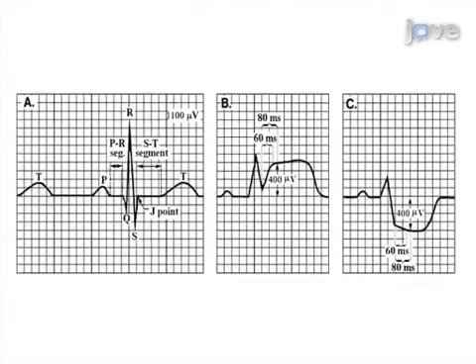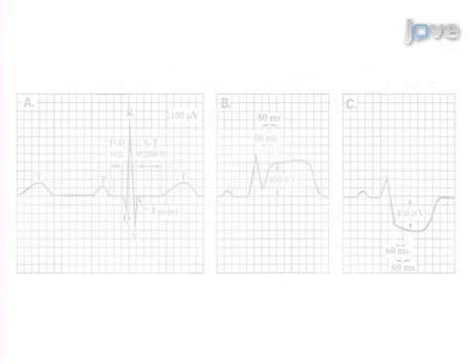Analysis of the data reveals the presence of transient myocardial ischemia as evidenced by ST-segment changes, either elevation or depression, during continuous 12-lead ECG monitoring. Myocardial ischemia is often clinically silent, meaning common symptoms associated with acute coronary syndrome such as chest, arm, or jaw pain do not always occur.